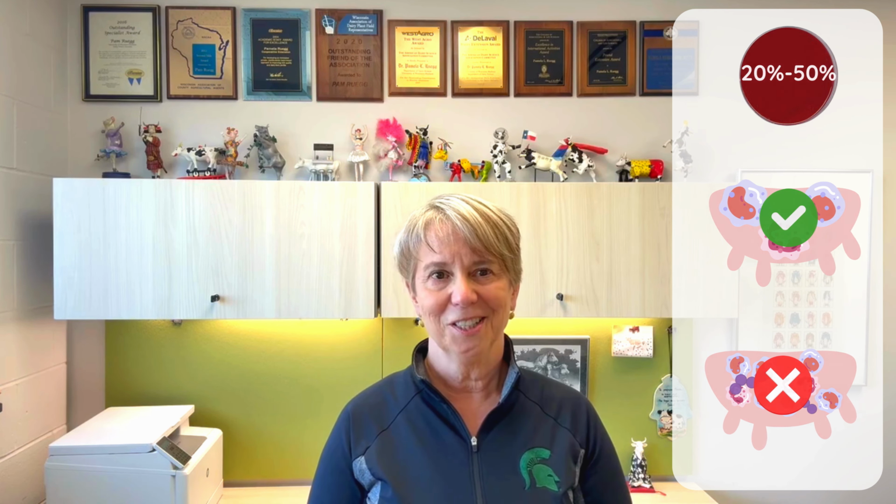So let's recap. Culture negative milk samples indicate good sampling technique and occur in about 20 to maybe even 50% of all the milk samples that we collect for mastitis. When we have a culture negative milk sample from a clinical case, the prognosis is often good. However, if we get a culture negative sample from a chronic subclinical case, it may indicate failed inflammation in a long-term case that may require culling or another intervention. You can review some of our pathogen-specific videos to get more details on those interventions.